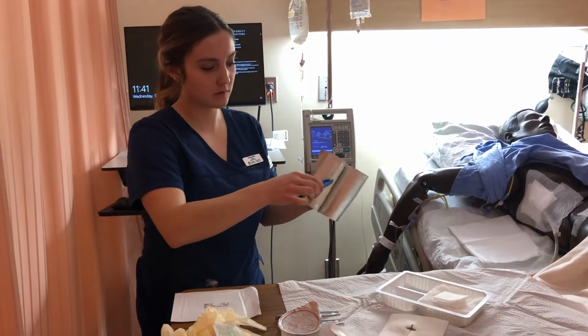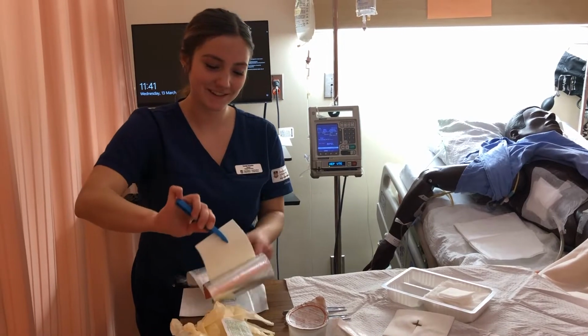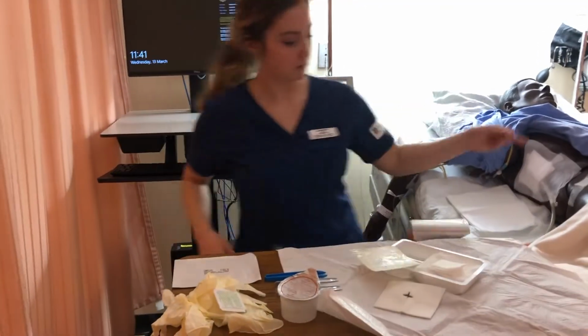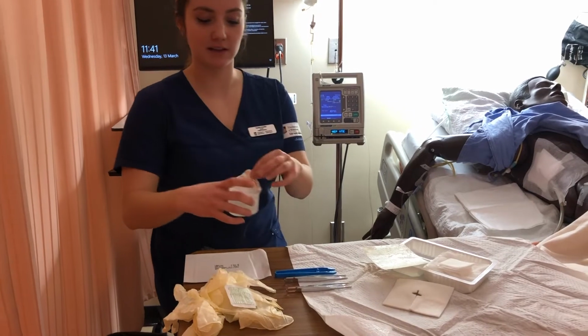Since the second nurse has done my paper, that part's not sterile anymore, so I won't use that. I'm going to add my normal saline now.